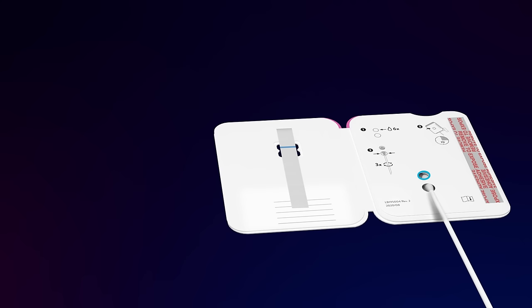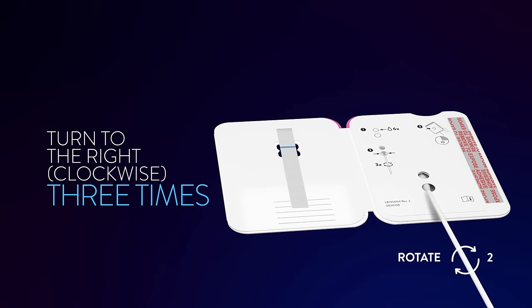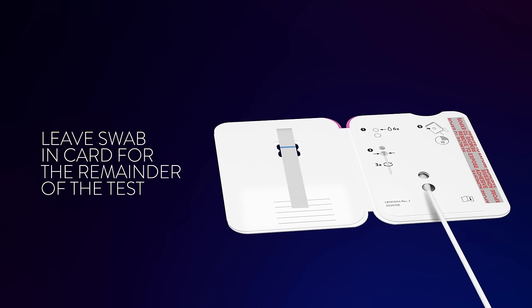Turn the swab to the right clockwise three times to mix the swab with the drops. Do not skip this step. Leave the swab in the card for the remainder of the test.